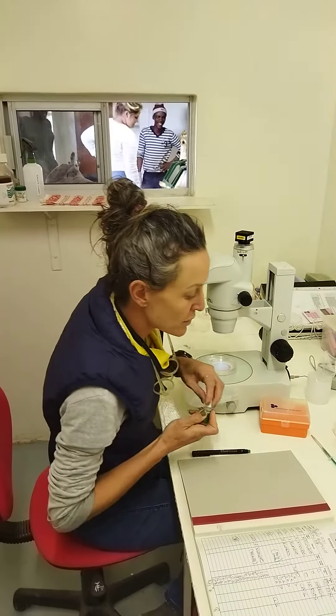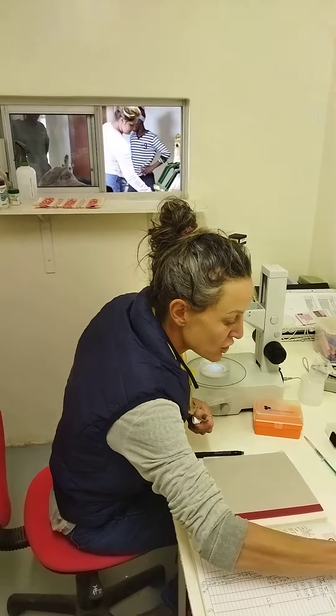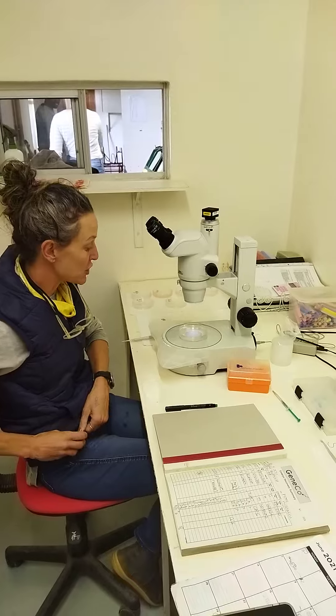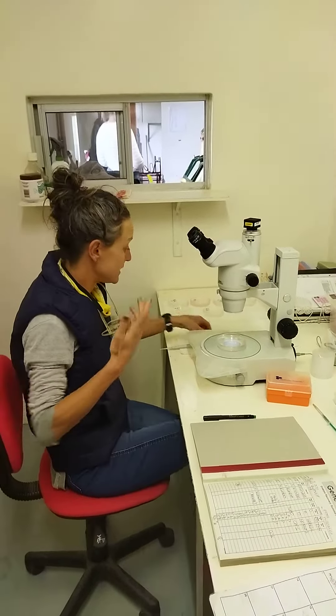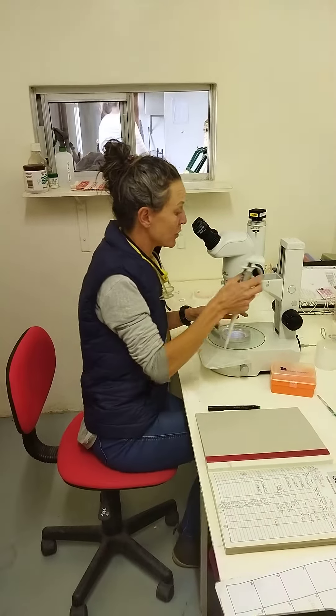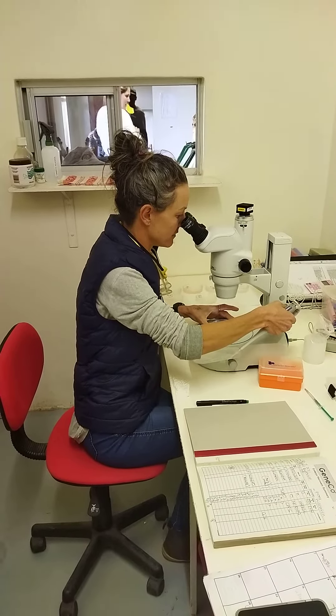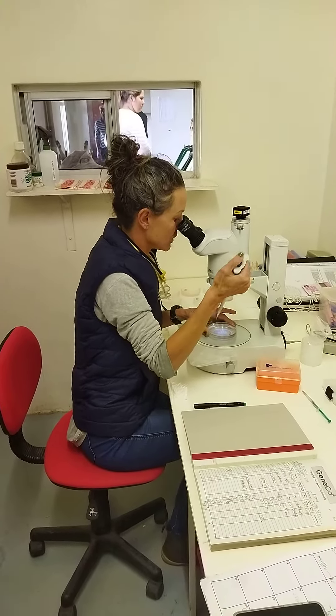We keep it warm so the embryos don't get too much of a shock when they come out. In that special media, fresh embryos can stay for at least 24 hours before we transfer them. They're very happy — there's antibiotics and all kinds of things to keep them happy.